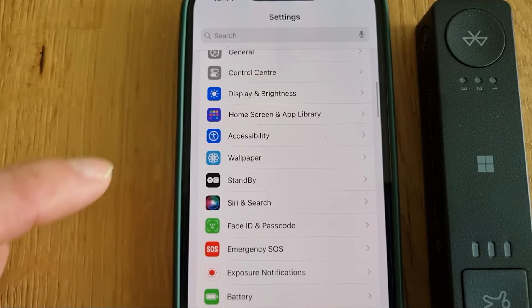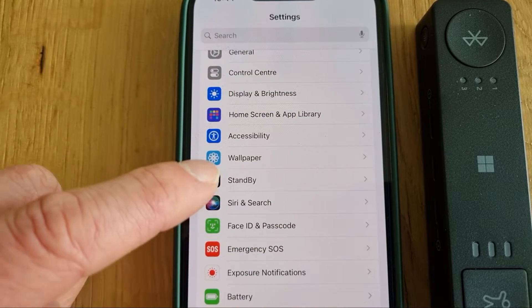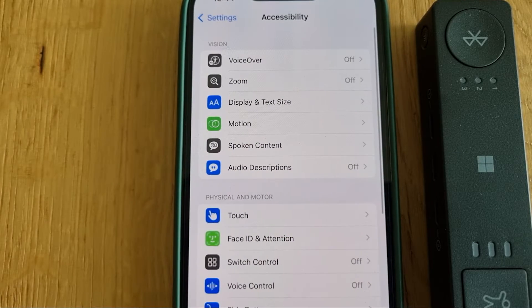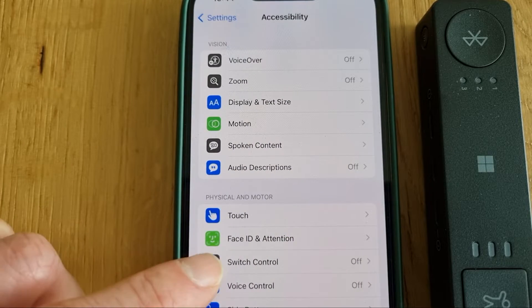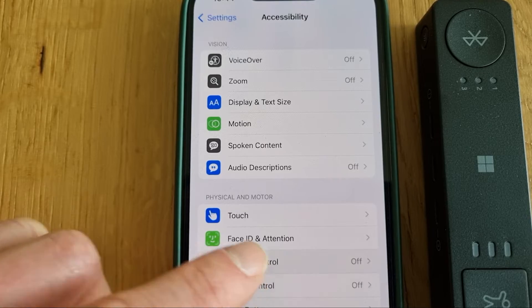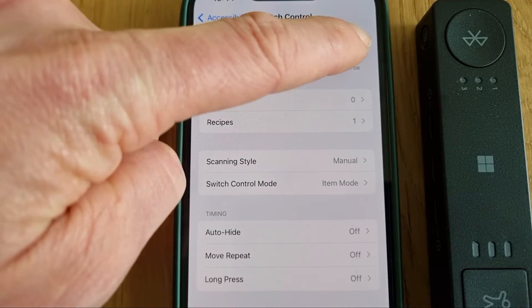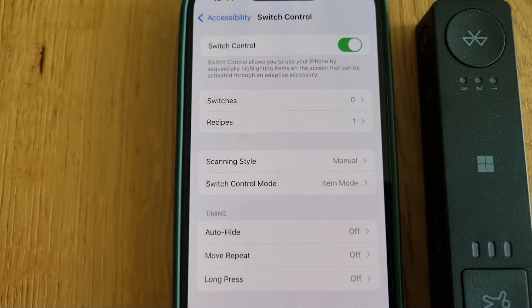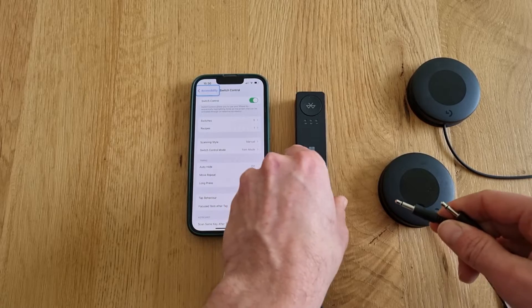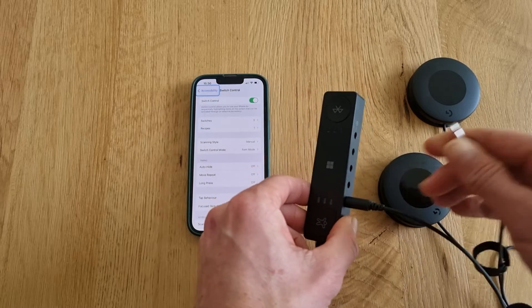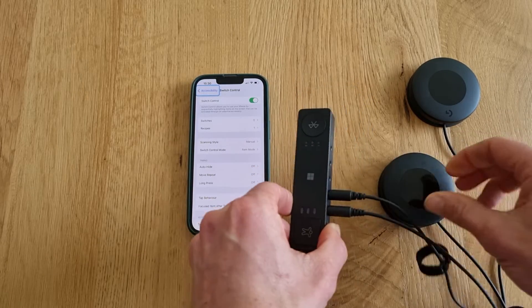Let's go into Settings and find the Accessibility tab. Under Accessibility, let's select Switch Control and toggle it on. Let's plug in two external switches into port 1 and port 2.